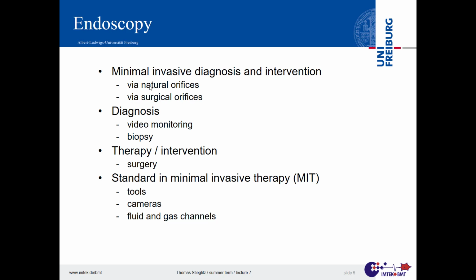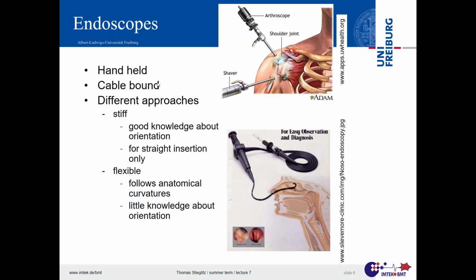I've seen more intelligent movies, but doing microsystems, it's sometimes quite amazing to see how people imagine to do that. I'm pretty sure in next years somebody will show up with nano robots being injected, self-assembling, doing things like that. And we always have to keep in mind, what force do we need, how to get there, is it empty, do we have space, do we get things out again, and those questions here.